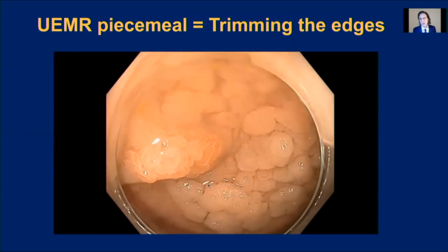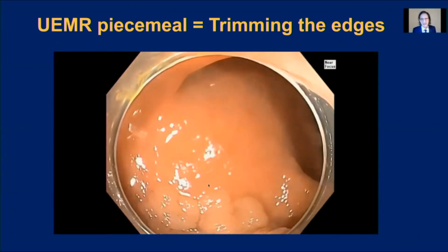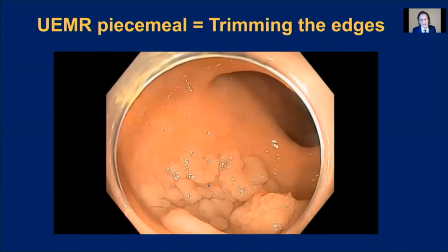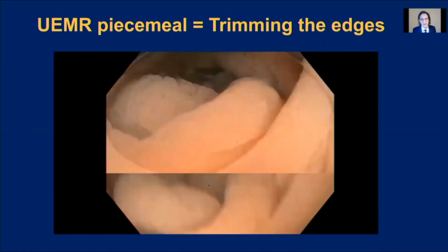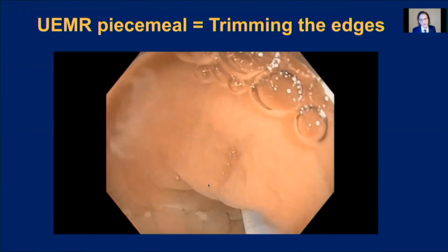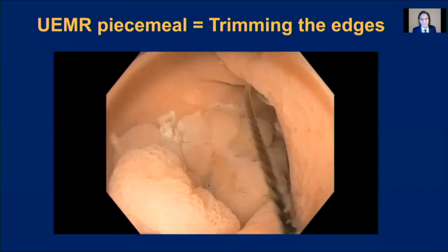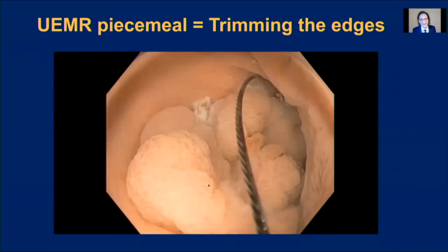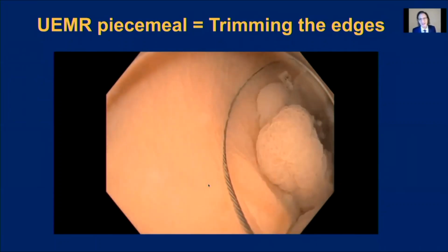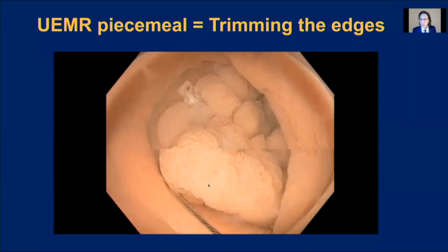So you can see this is quite an extensive lesion. It is at the rectosigmoid junction, and I always try to resect this en bloc, but I think given its very, very large size, it would be a pleasant surprise if I succeeded. But you can see with the contraction and the floating effect, we can really get our snare pretty well around the lesion.